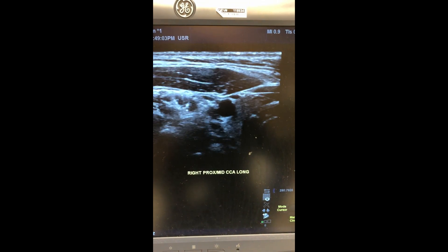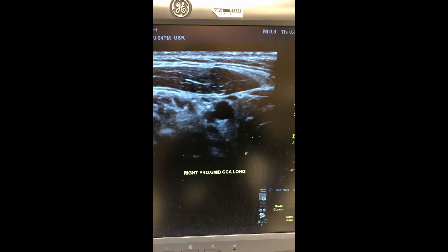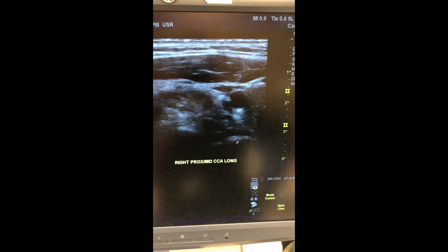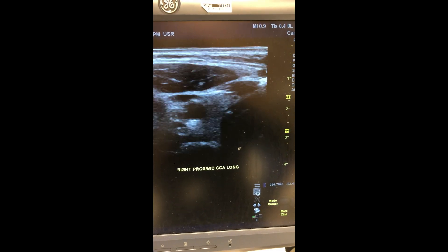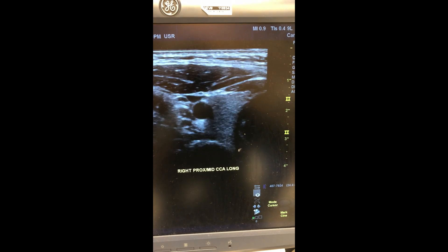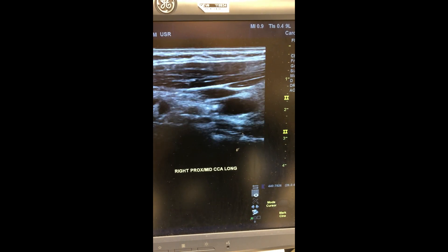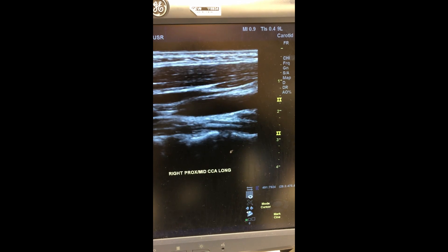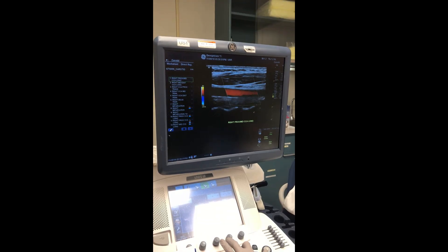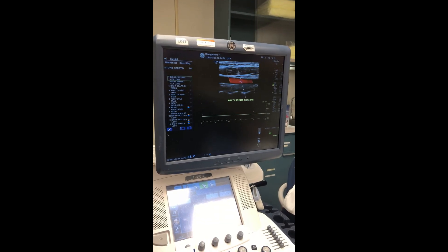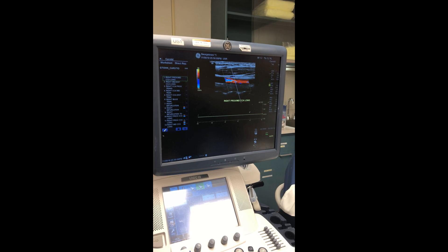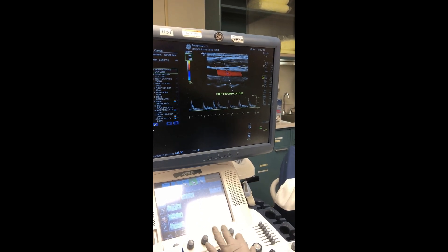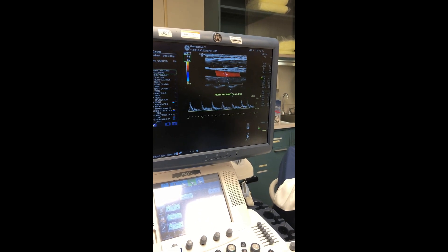Now we're ready to take images for our study. First we obtain a transverse grayscale image, then turn to obtain our longitudinal grayscale image. Use the heel-toe technique to optimize the vessel. Apply the color box and sample gate using the appropriate steering and angle correction.